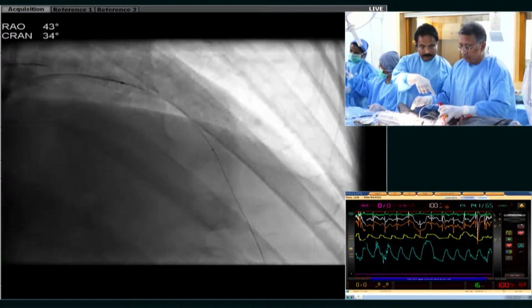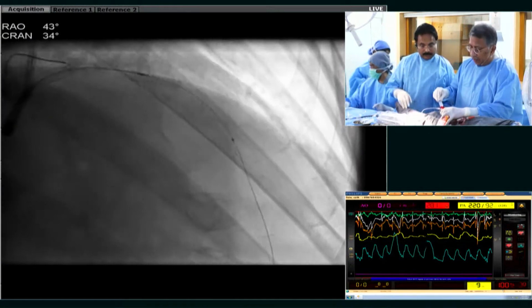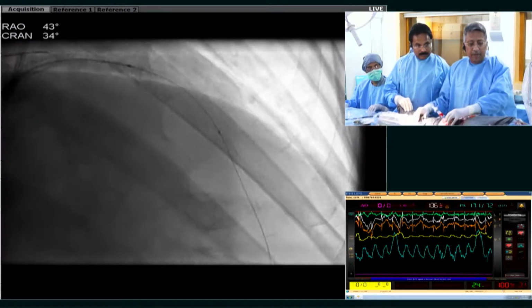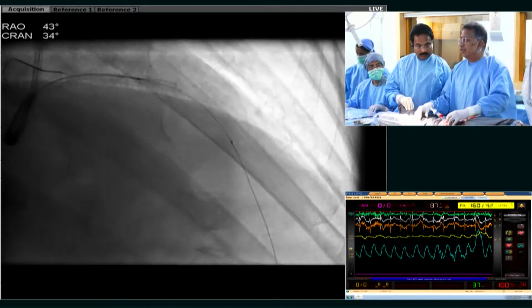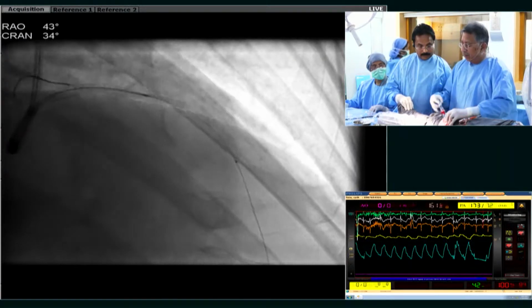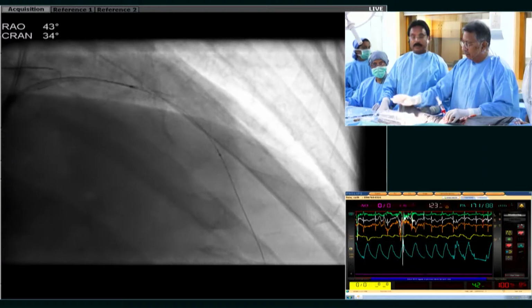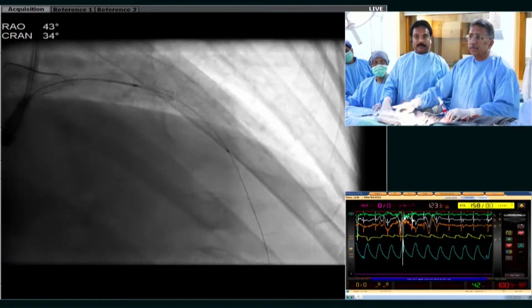Now we have to flush it. What is that? Now he is vomiting. I think he has a little pain also. So let's just settle him down before we do this image. Are we on live view right now? Shall we give a little hydrocortisone also, could be the contrast?